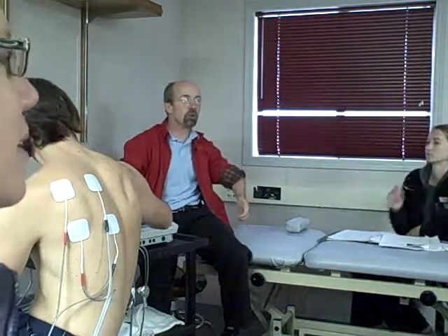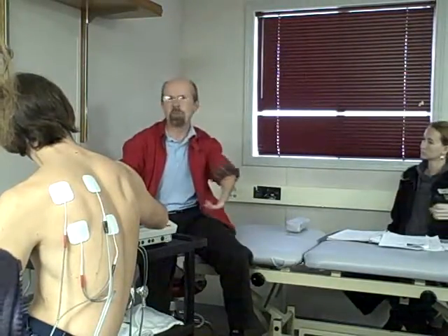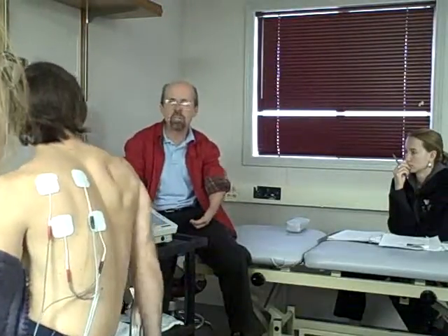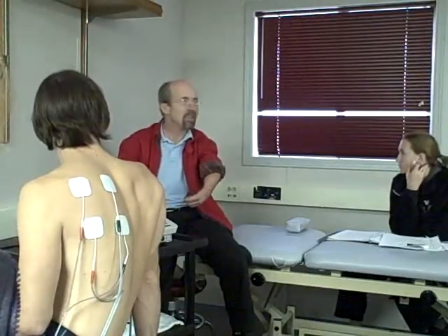By default, the nature of it is when you're turning up the intensity, you are simultaneously turning the intensity the same on both channels. However, in the middle of a program, for this particular one, actually most of them now, you could go back and change the intensity to independent channels. But most people don't really get into that. Generally speaking, if they change anything after they set it, they hit the balance button, purely for subjective reasons.